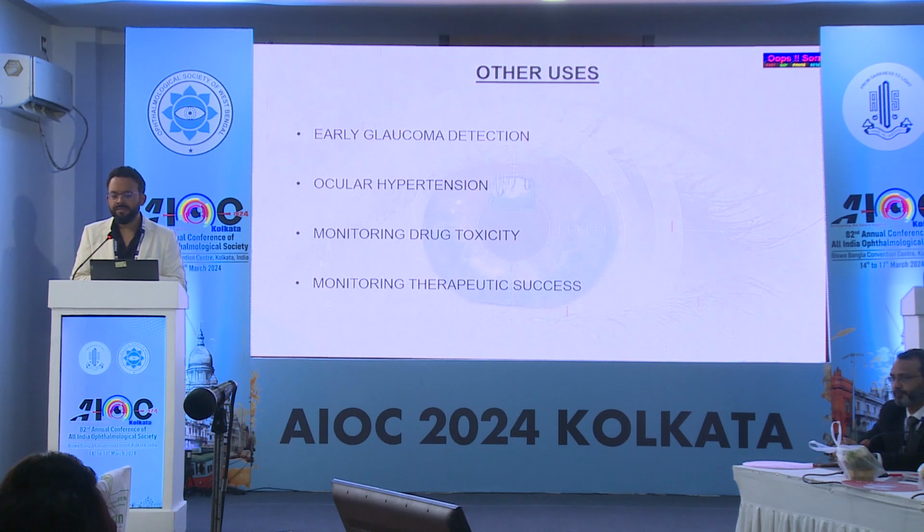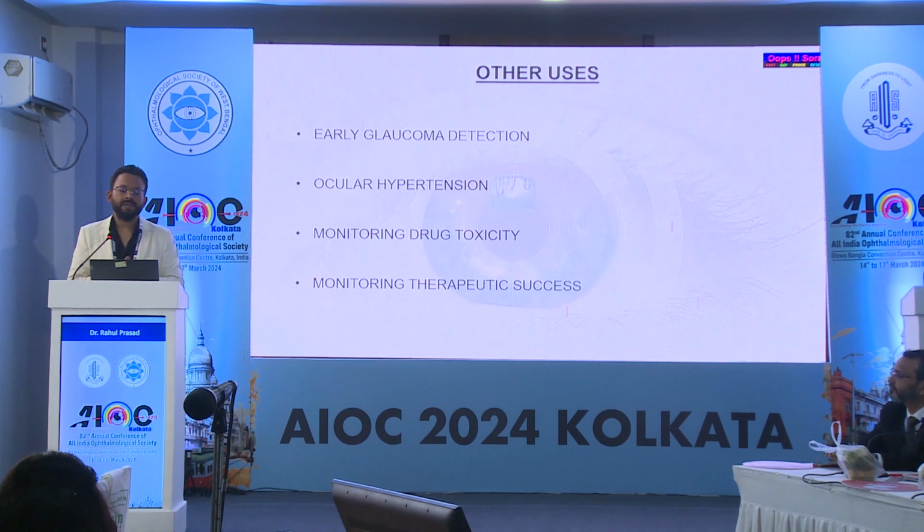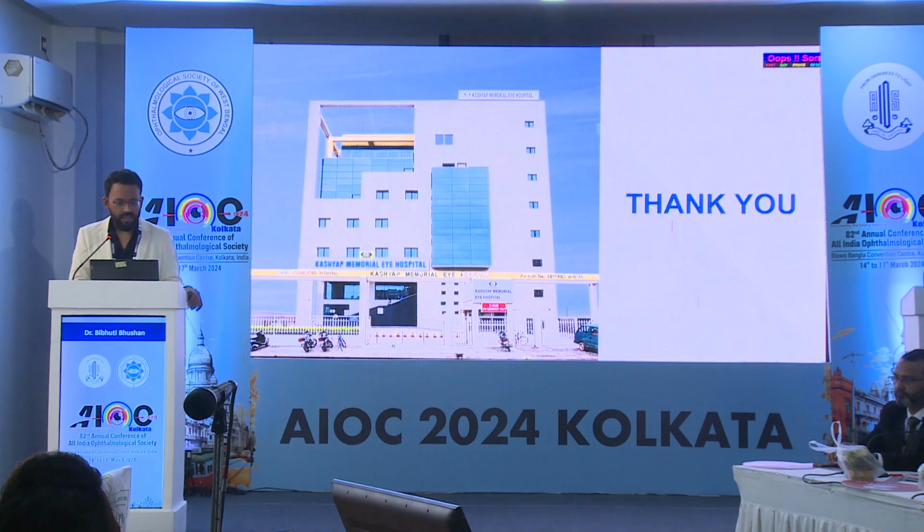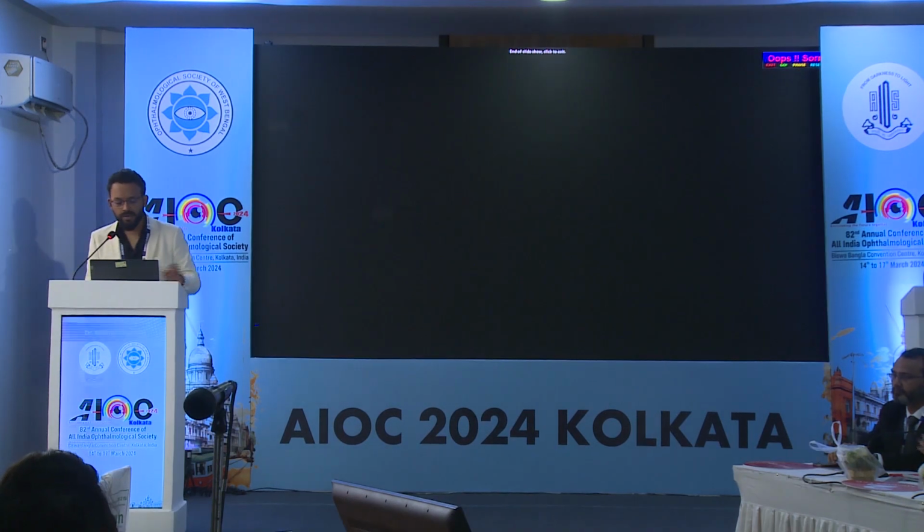Apart from that, monitoring drug toxicity in patients taking neurotoxic medications like chloroquine, etc., and monitoring therapeutic success after we instill steroids for optic nerve dysfunction, or after anti-VEGF injections for a macular edema case. Thank you. That's all for pattern ERG.